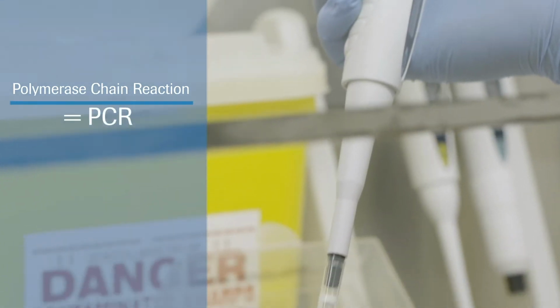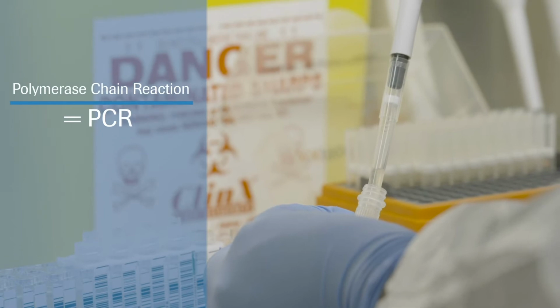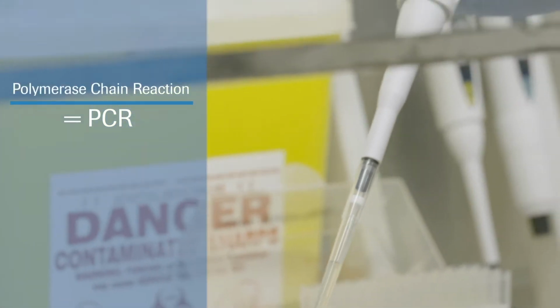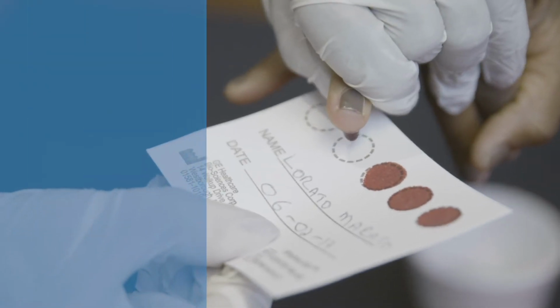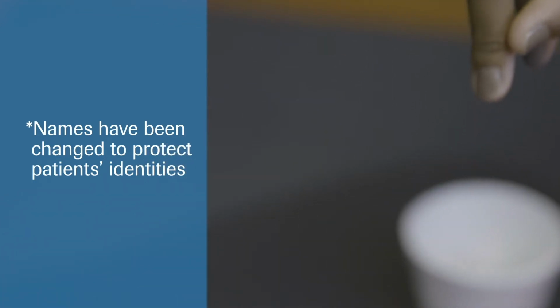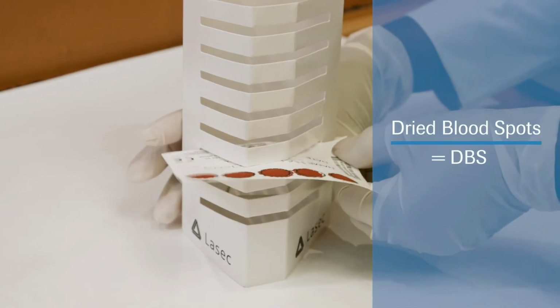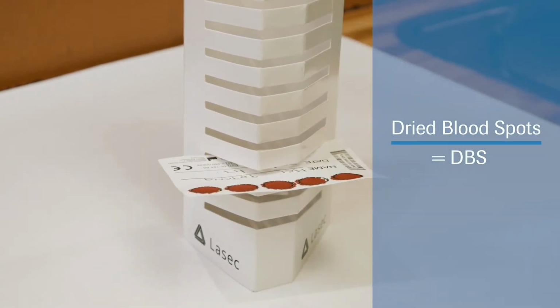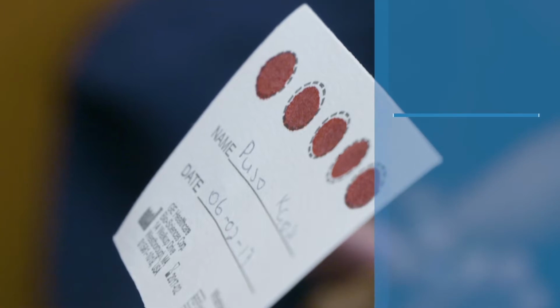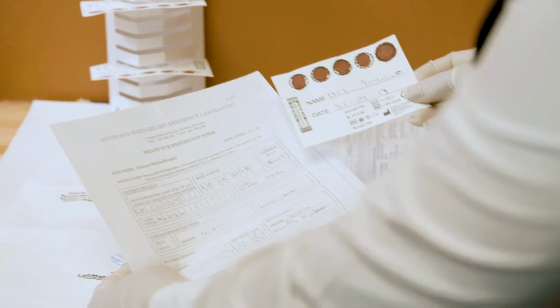VL tests performed on plasma are the standard for measuring viral load using a laboratory technique called polymerase chain reaction, or PCR. However, advances in technology make it possible to measure HIV viral load using dried blood spots, or DBS. You may already be familiar with DBS samples, as these have been used for early infant HIV diagnosis for quite some time in many countries.